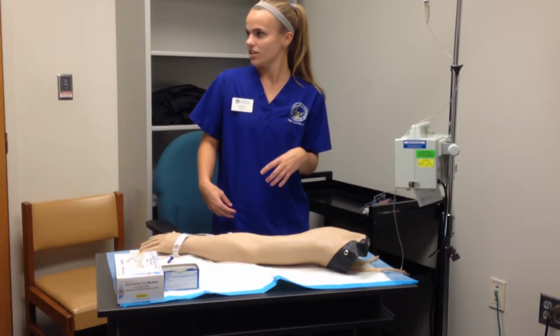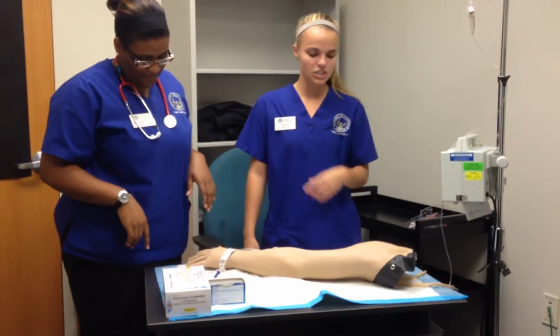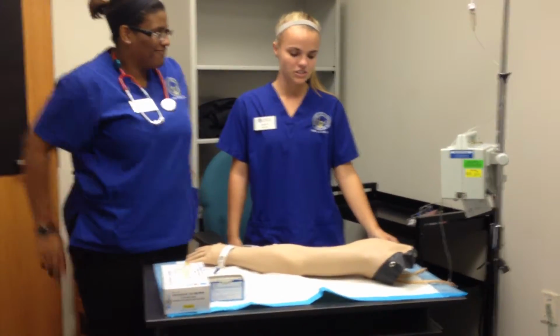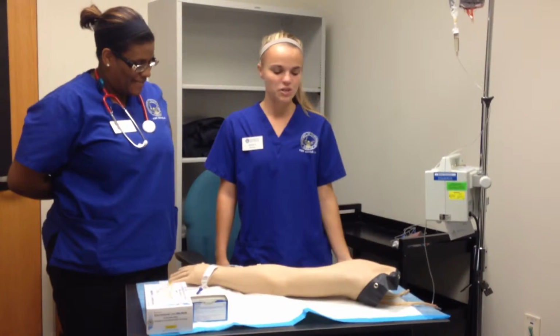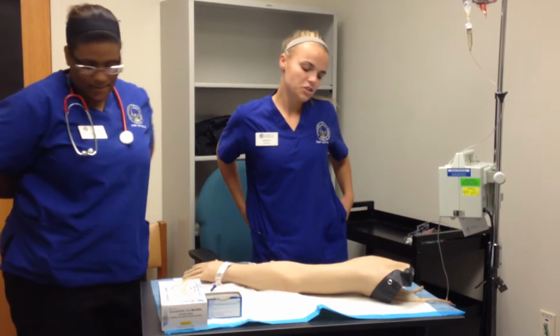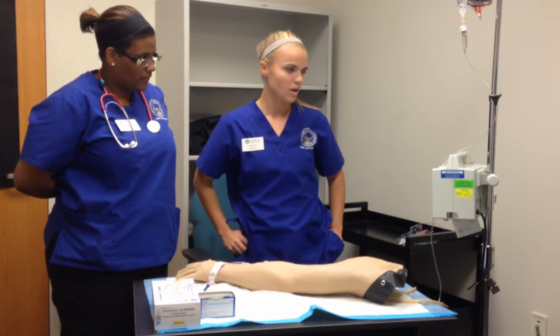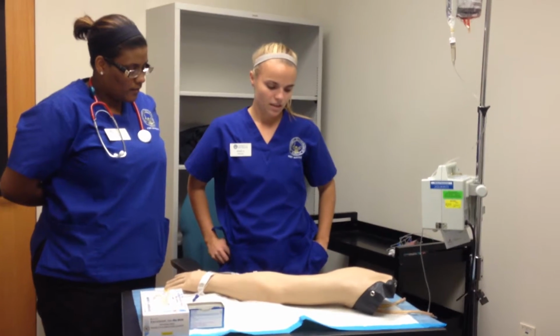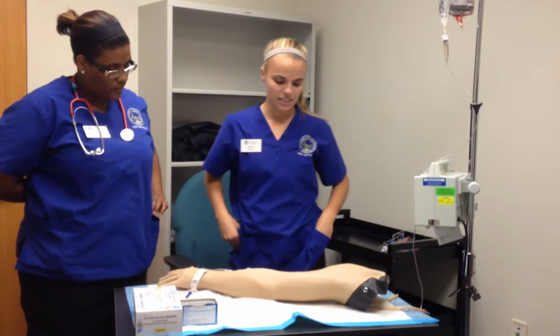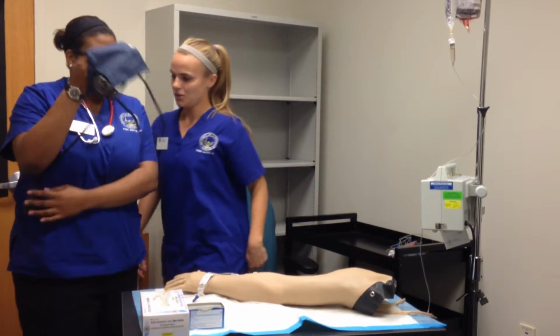Hello. I'm Stacey and this is Anicia. We're St. Francis nursing students. We're just coming in to do your blood transfusion. It'll take up to 2 to 4 hours, and hopefully we'll get that low hemoglobin back up for you. First, we're just going to get some vital signs. Anicia's going to get your vital signs going for you. I'll get out of your way.